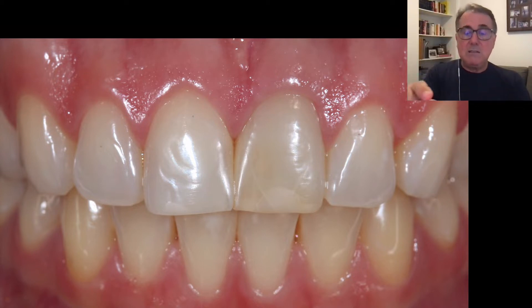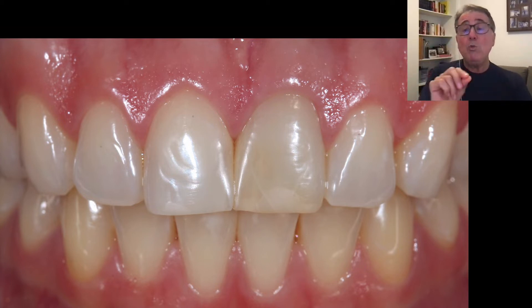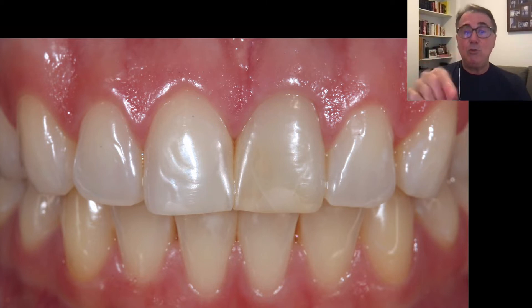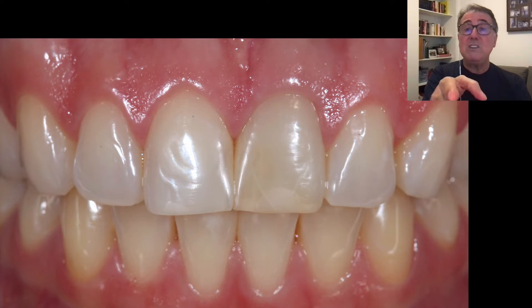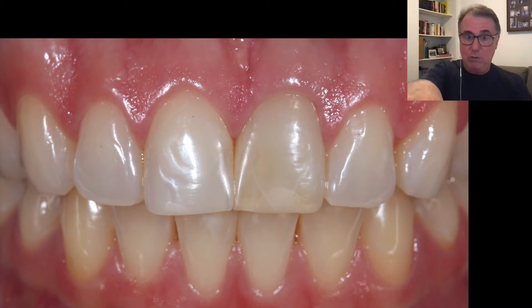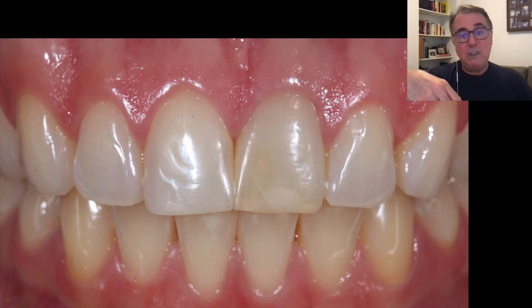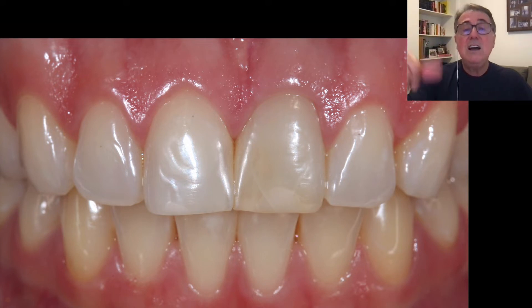Usually in a case like this, with a vital tooth like this, we do a bleaching tray and bleach only that tooth. We did that and got a slightly better result — the tooth was darker before. But still, the patient wanted to do a veneer on top of that tooth. She wasn't happy about it. She's a dentist, and she wanted to do a ceramic veneer. So let's see how we approach this case.